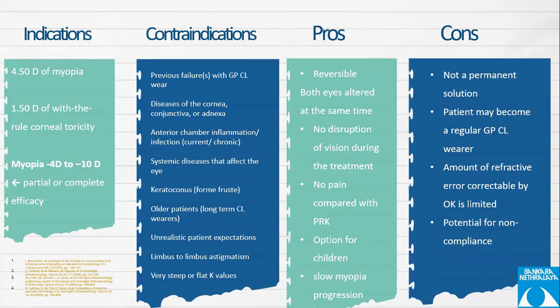So coming to the cons, it's not a permanent solution. The patient may become a regular gas permeable contact lens wearer, which is not ideal. The amount of refractive error correctable by Ortho-K is limited, and there's always a potential for non-compliance.